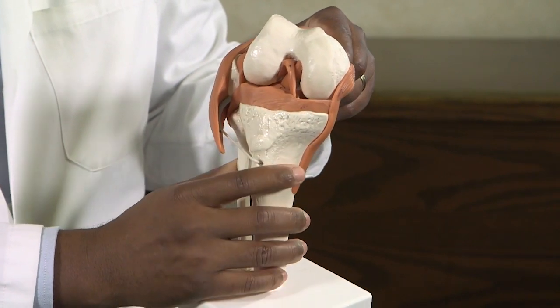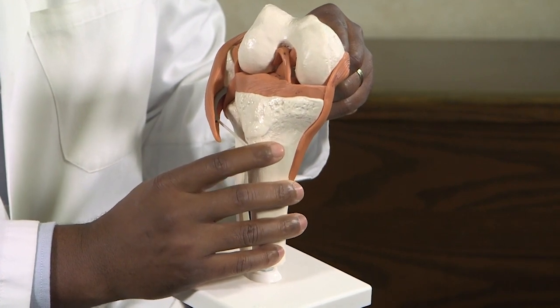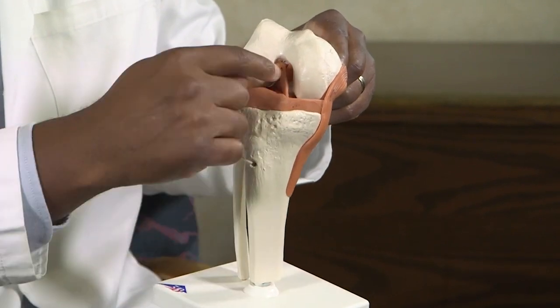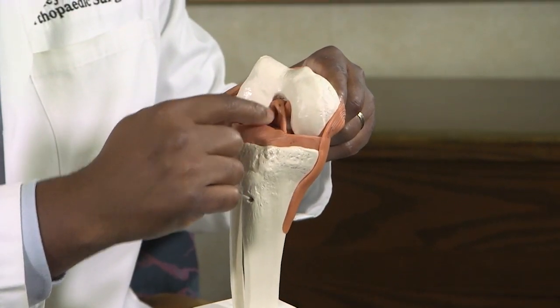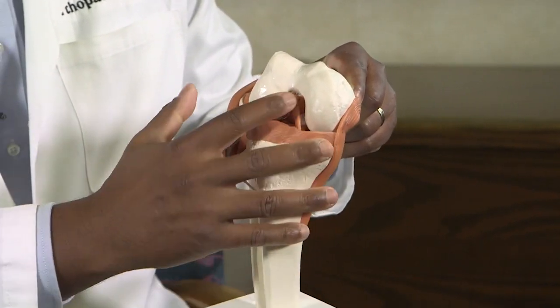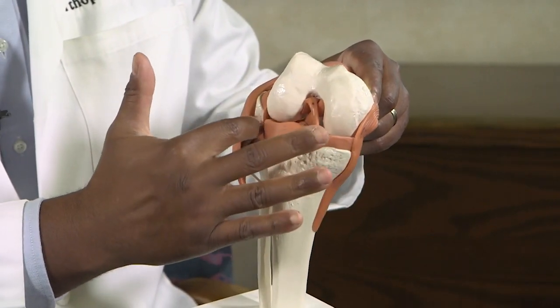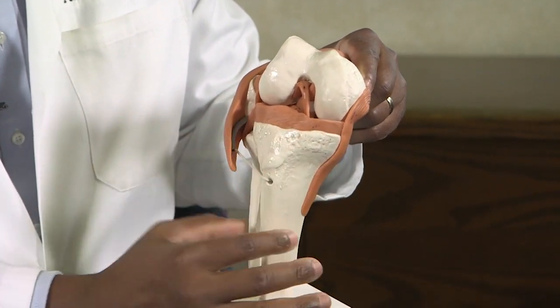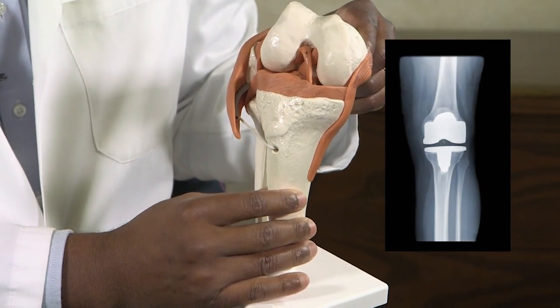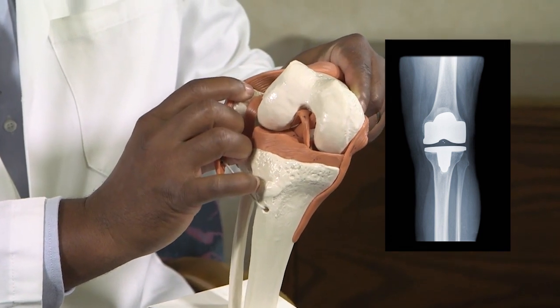The final preparation involves the upper part of the leg bone, or proximal tibia. In order to prepare the proximal tibia, it requires removal of one of the main cruciate ligaments, and in some cases both cruciate ligaments, the ACL and the PCL, removal of the entire meniscus, and removal of the cartilage and subchondral bone. And so you've got three components: a tibial component, a femoral component, and the patellar component.